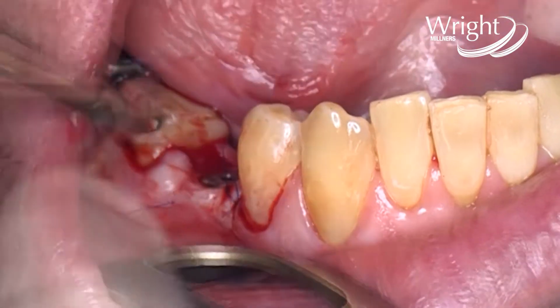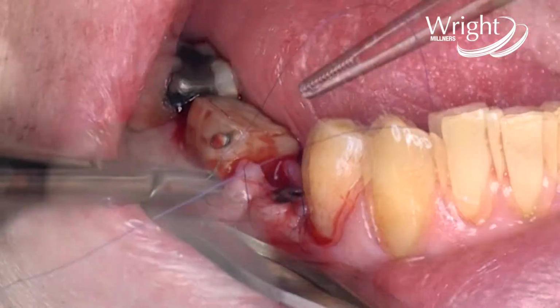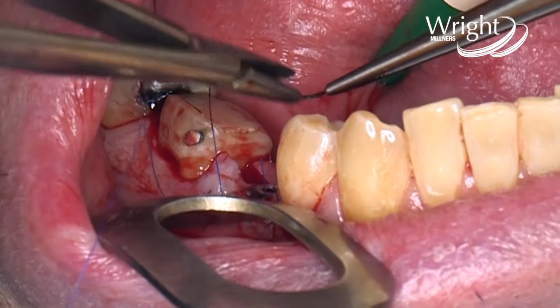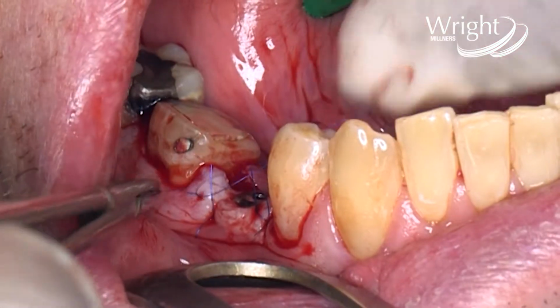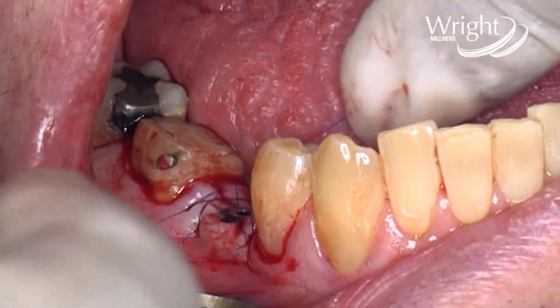And these sutures can't be under high tension, they're passive, or they will snap, which is another reason why we use them. We don't want too much tension on the tissue. The only time I use a braided suture here is if it's a patient with bleeding disorders and I need to have more compression on the site. But these are not dissolving, so 10 days later we need to remove the sutures.